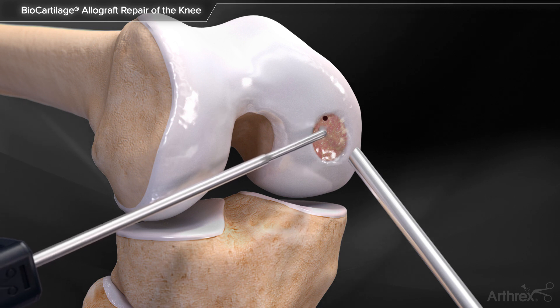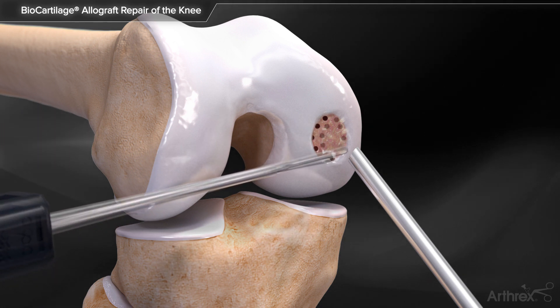Utilize the PowerPic to create bone marrow access channels to complete the microfracture procedure.